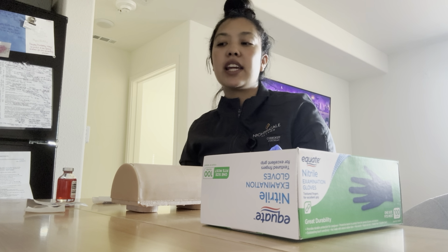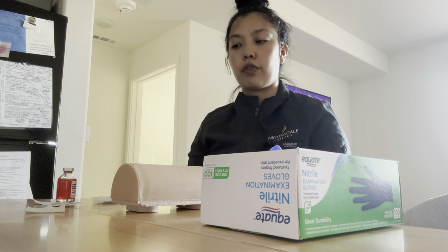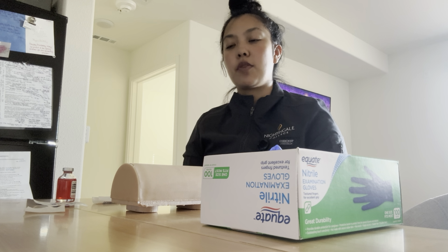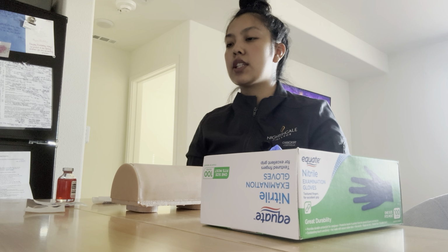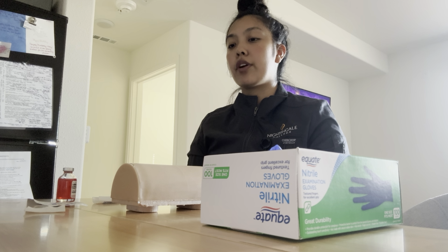Hello, my name is Madi. Today I'm going to be your nurse and I'm going to be injecting morphine for you. Can I please have your first name, your last name, and your date of birth? Thank you, Ms. Tupo. I'm going to make sure that the patient's ID band is correct. Do you have any known allergies? No? Okay, perfect. Have you had morphine before?